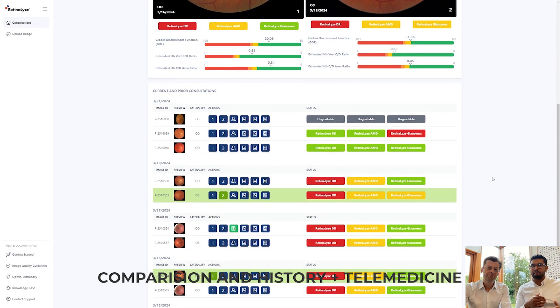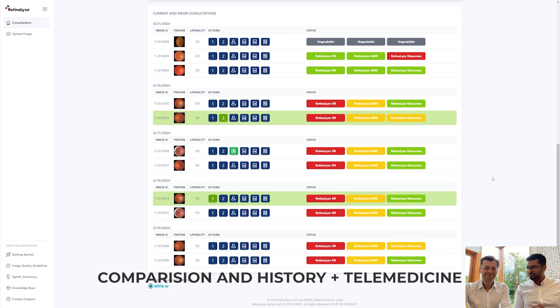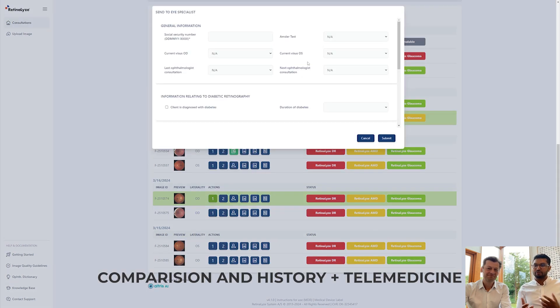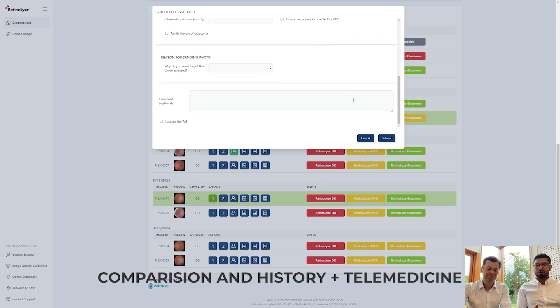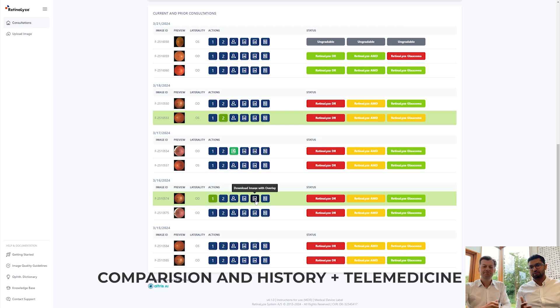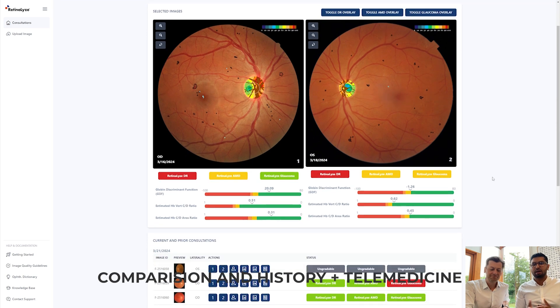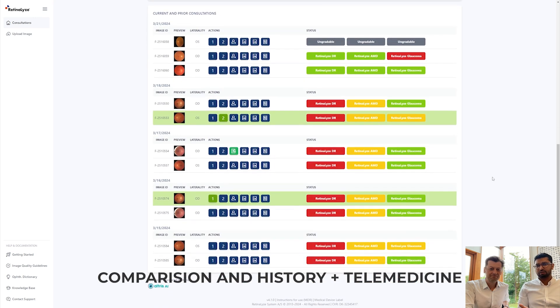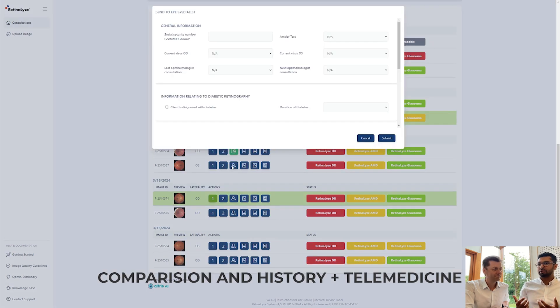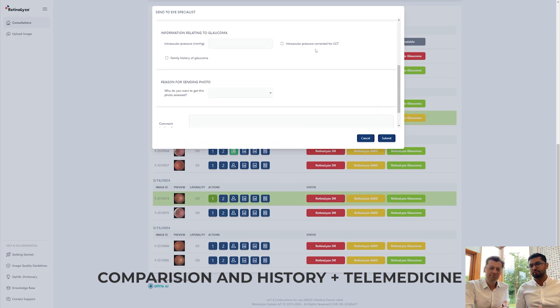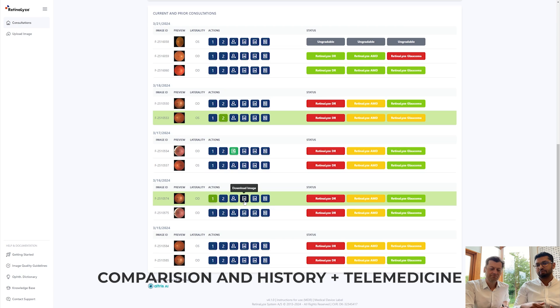Eye diseases often develop over time, especially those that are not easy to detect. So we have a feature for comparing historical images, or comparing left and right eye to detect bilateral diseases. You can see the full history of consultations for a patient and compare those images. You can also send a consultation to the telemedicine solution if you have doubts or want to know how quickly the patient should visit a local ophthalmologist. You can also download images or print a PDF report.